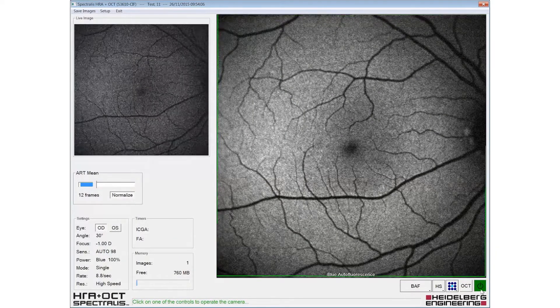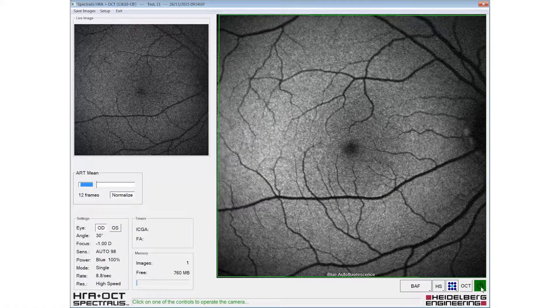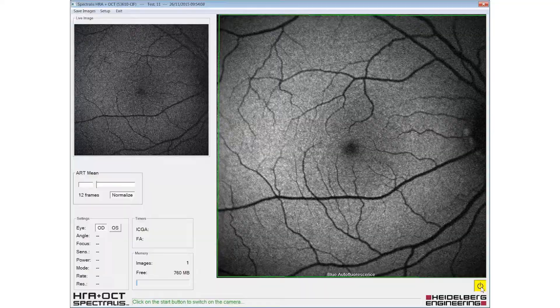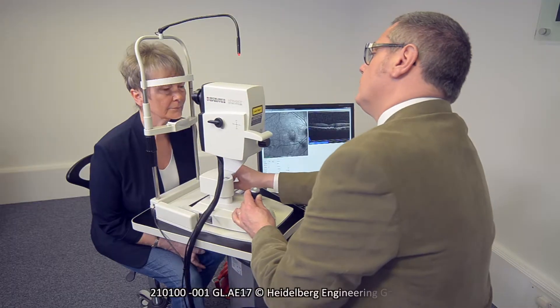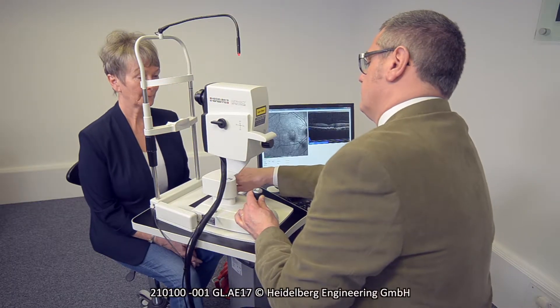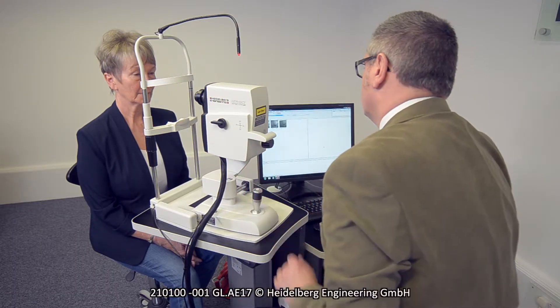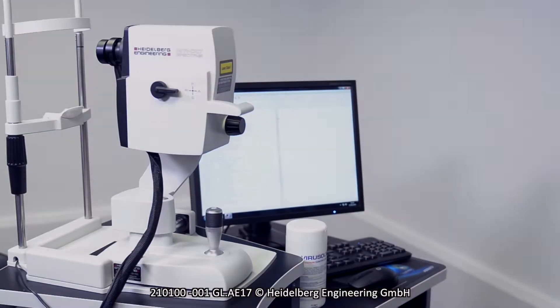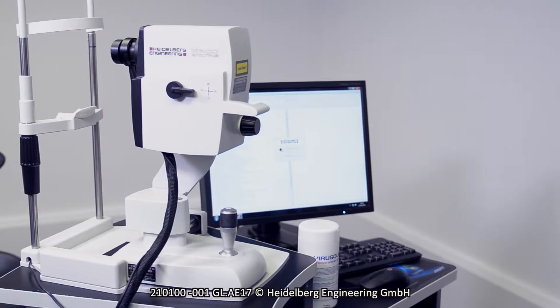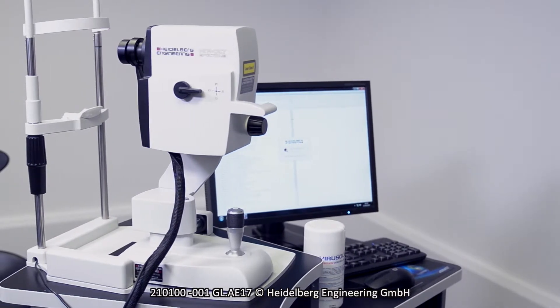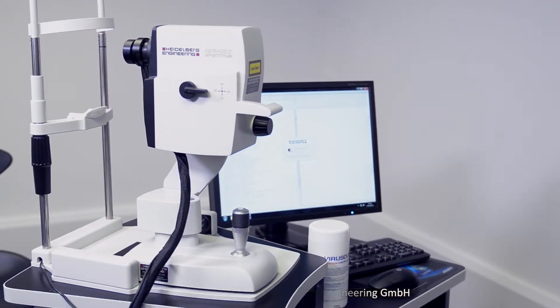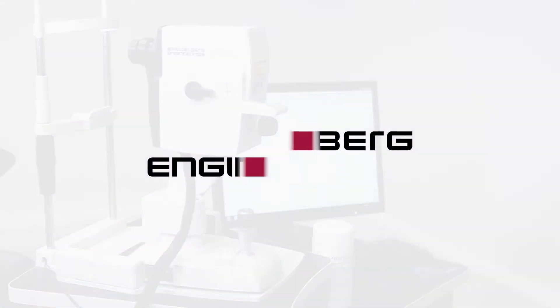The images should be saved and the patient should be instructed to relax and sit back from the instrument. For more detailed information on this and other techniques, please refer to your Spectralis user manual.